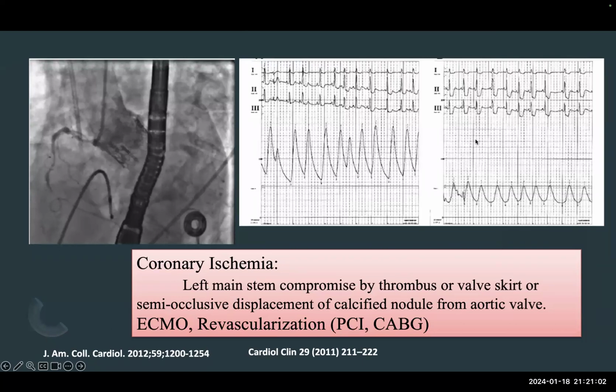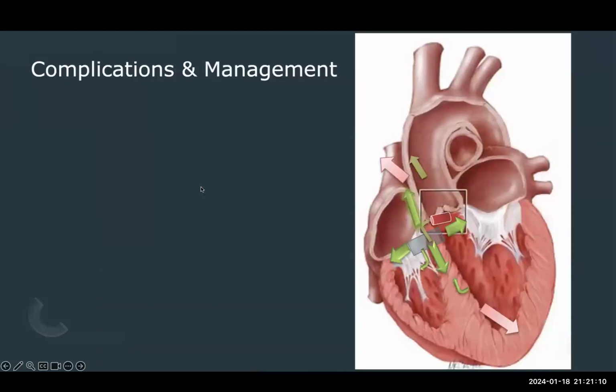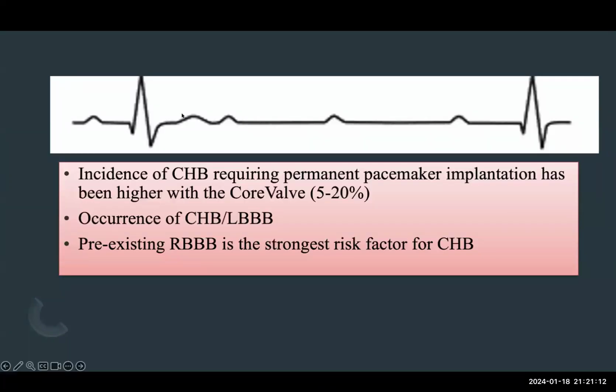Doctor, the last question is regarding the conduction problem post TAVI. Yeah, this is a very important question. Is it affected by the type of the valve? Yes, self-expandable more than the other. And the second thing is, how long after TAVI should I monitor for conduction problems? In your exam, say 48 hours. For the sake of your exam.